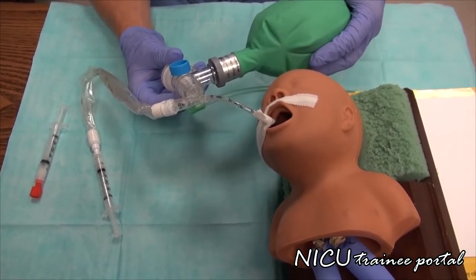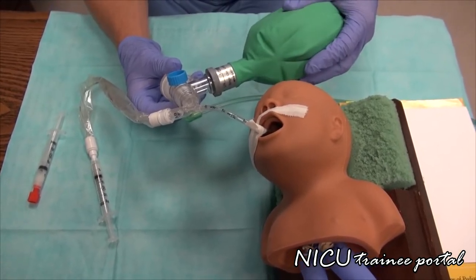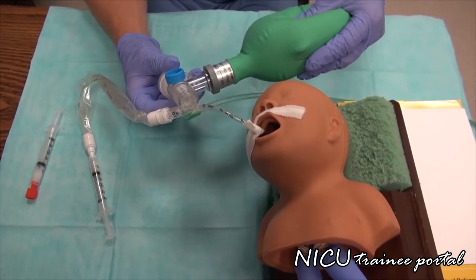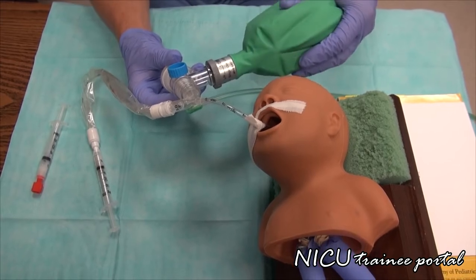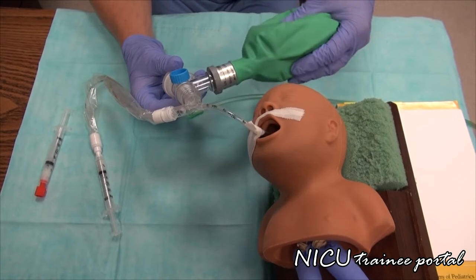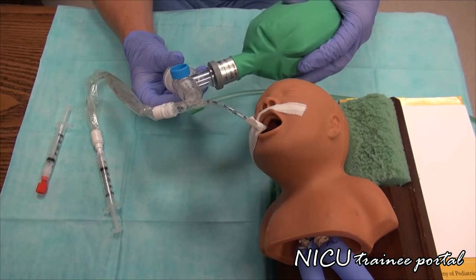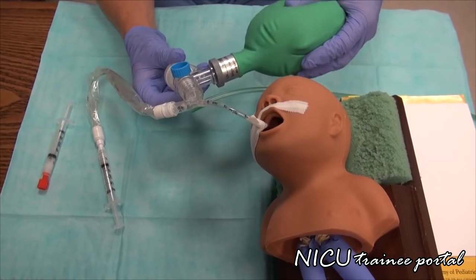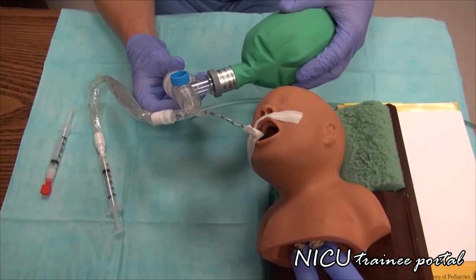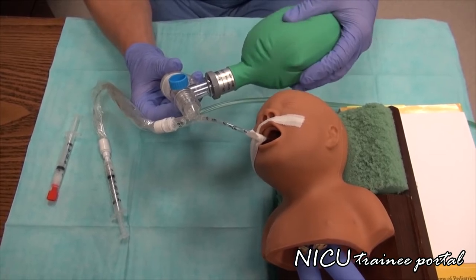Prior to administration of the first aliquot, things to consider: making sure the baby is stable, vital signs, saturation, heart rate. Also, after intubation, listen for bilateral breath sounds, making sure the tube is in proper placement as well. So prior to administration, you might bag at around 40 to 60 breaths a minute, or bag at a normal rate prior to administration of the surfactant.